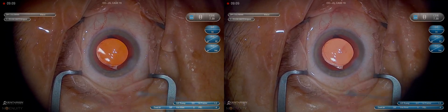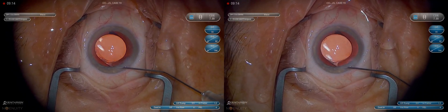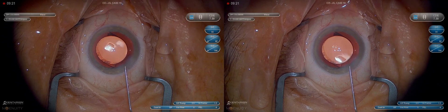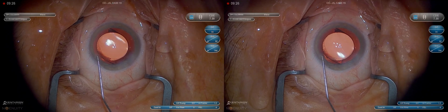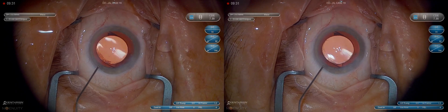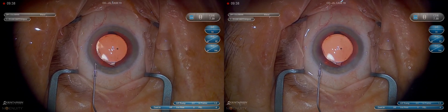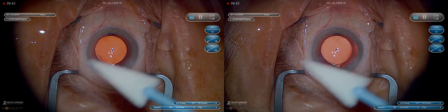We're hydrating our wounds. I always pick a point 50% between the inner and outer edge of the wound, almost perpendicular with my cannula tip. Get it in a good position and then get a hydration. A little reverse burp there to take the inner leaflet and make sure it's laying flat on the cornea so it doesn't allow fluid to continue leaking out. We can hydrate only half of our paracentesis in almost every case — make sure that hydration comes all the way around to the other side, and usually that saves us a step from hydrating both sides, as long as it's well-sealed.